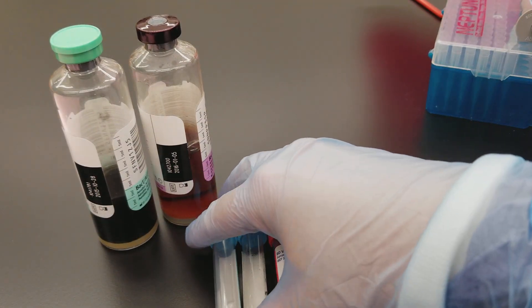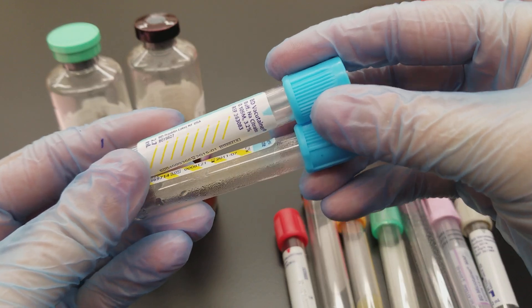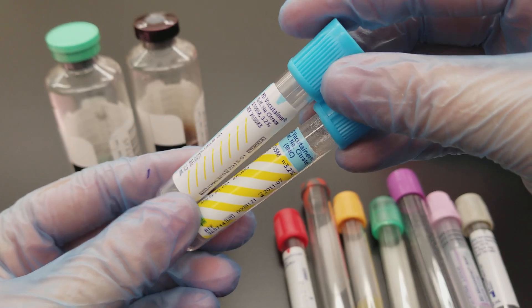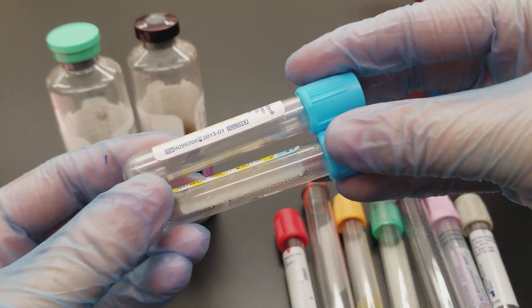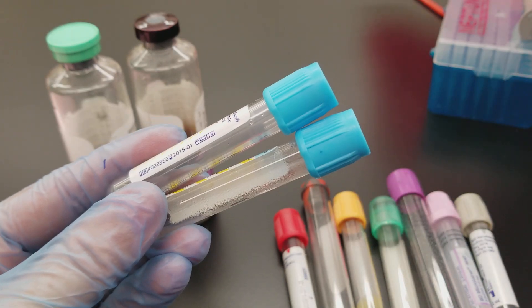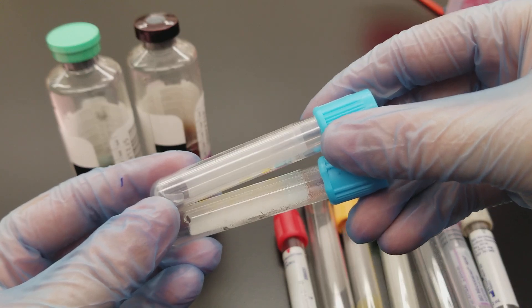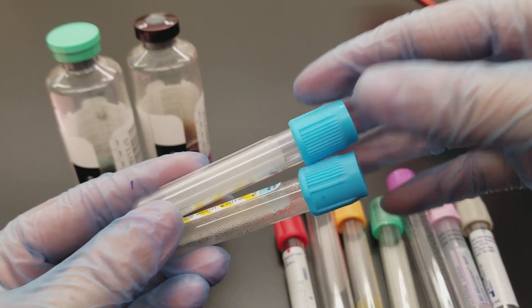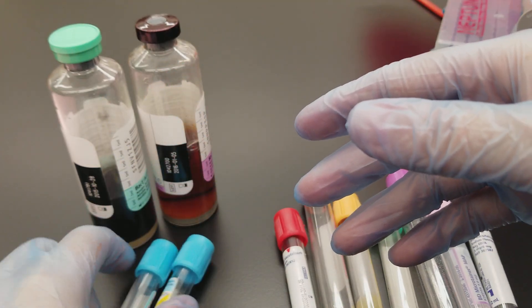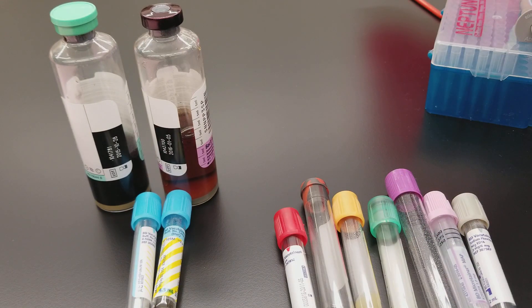Moving on to the blue tops — these are sodium citrate tubes. They require a 9 to 1 ratio of plasma to anticoagulant. This anticoagulant pulls out calcium so that the clotting cascade factors are preserved, because calcium happens to be one of the clotting cascade factors. When it's pulled out, that eliminates the ability for the clotting cascade to happen. When you go to perform testing, you add reagents that have calcium in them so you can detect any deficiencies or qualitative issues with the patient's factors or platelets.